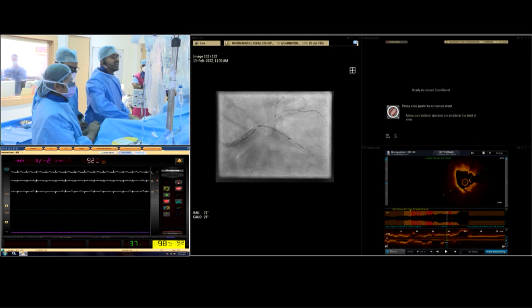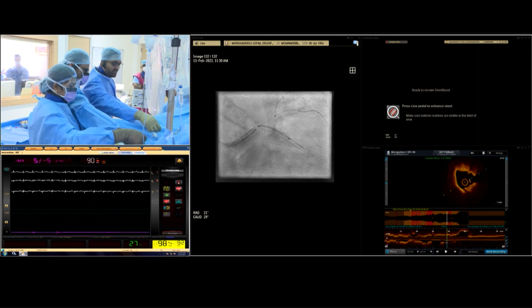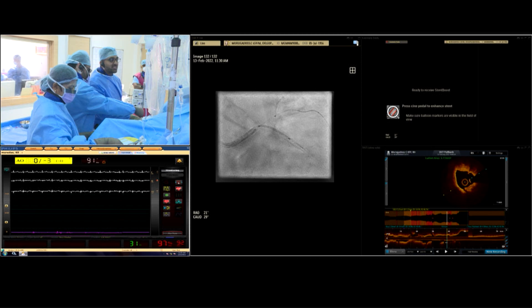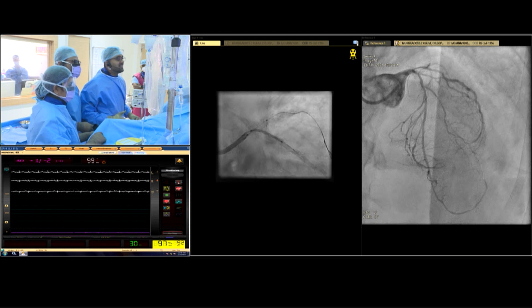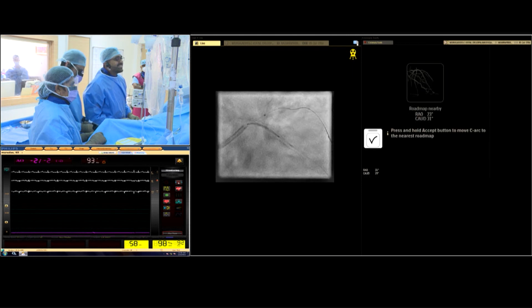Sometimes you place for a mini crush, and then the stent foreshortening will make it a micro crush. Absolutely, and many a time I think I will achieve something, but very often I'm wrong. What I achieve is completely different, and then I just have to act as though that's what I aimed for. Intention to treat.